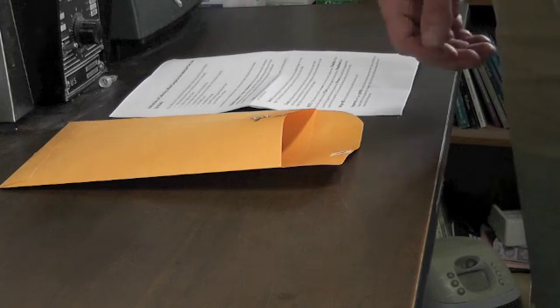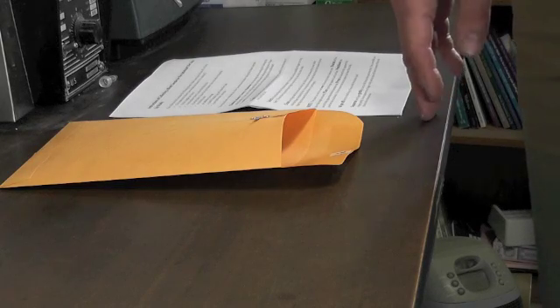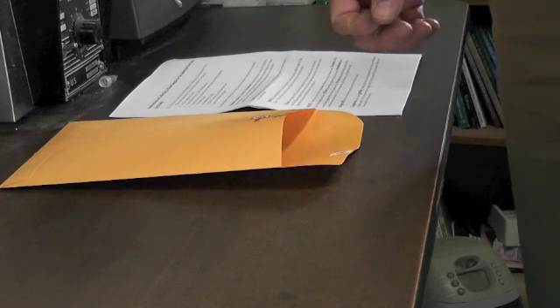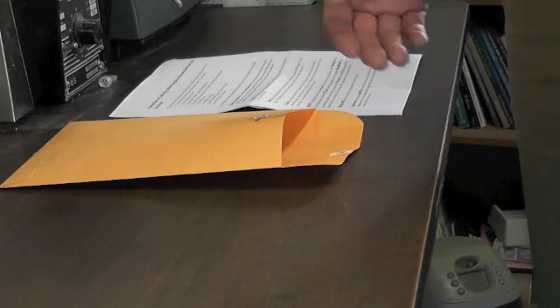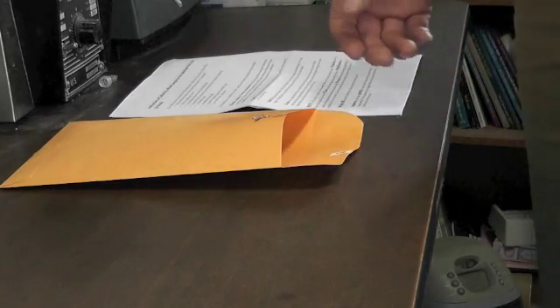In this video we are going to demonstrate how to take a good blood sample using the finger prick method. This enables you to take some lab tests in the convenience of your home without going to a blood collection facility.